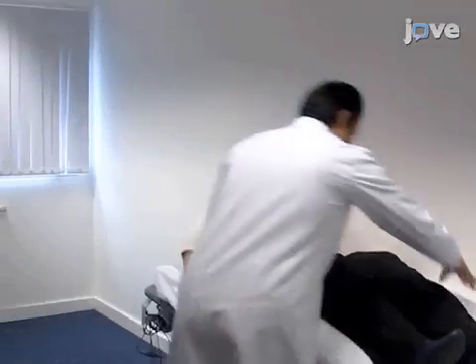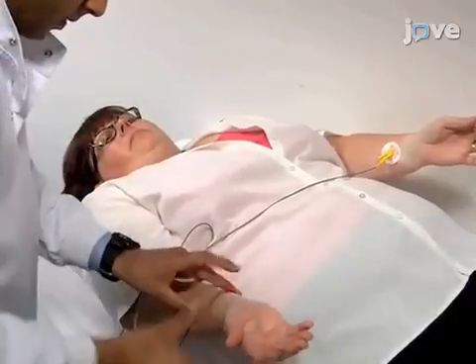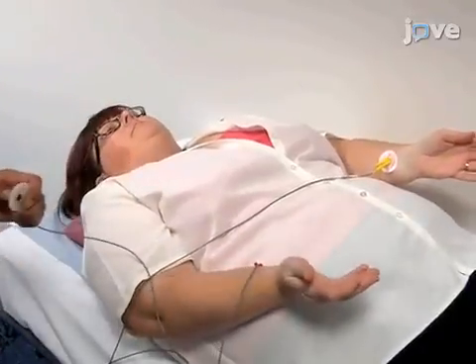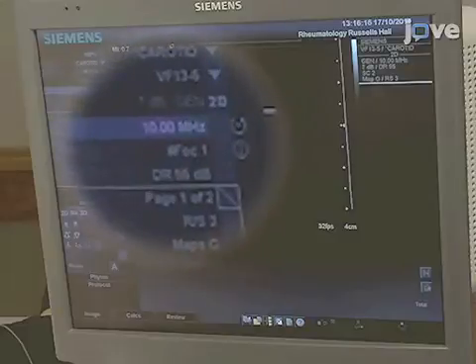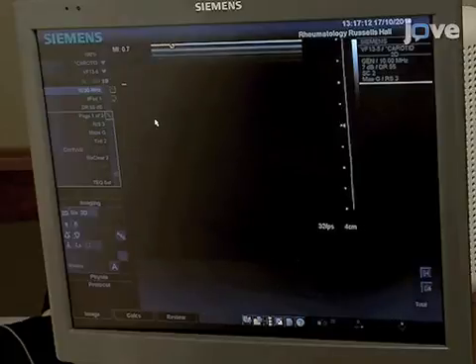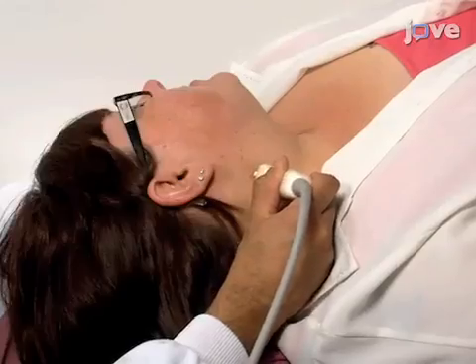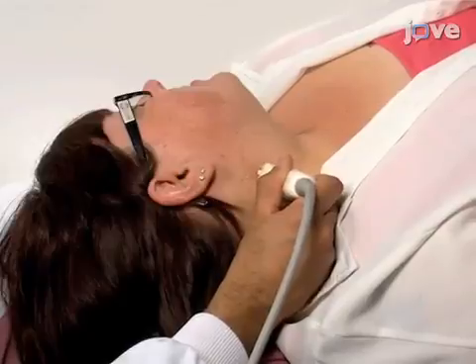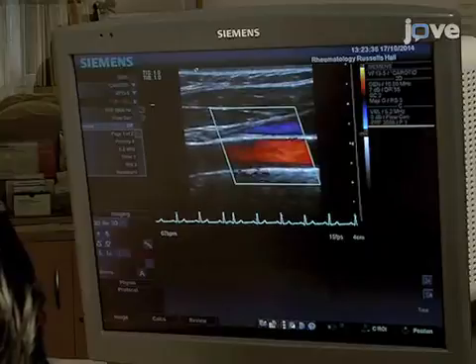For this measurement, have the participant lie down comfortably on a bed with a pillow. Then set up the ECG leads for a basic trace — attach them to both arms and to the left ankle. Next, go to the menu and set the scanning frequency to 10 MHz and the recording depth to 3–4 cm, then adjust the gain as before. Now ask the participant to roll their head slightly to the left and use the linear array transducer to scan the right carotid artery, searching for a bifurcation point in the vessel.